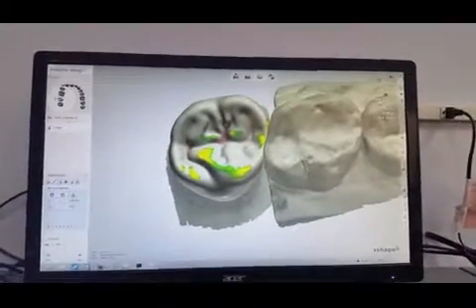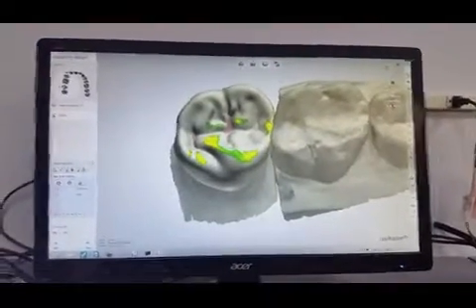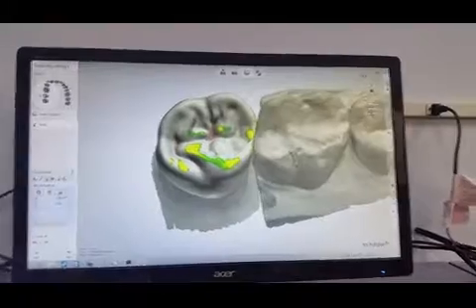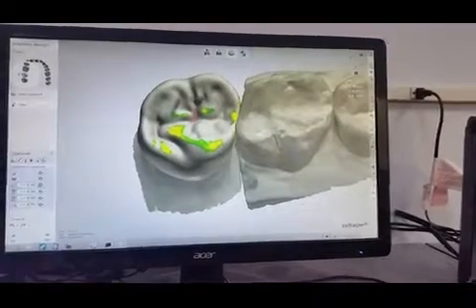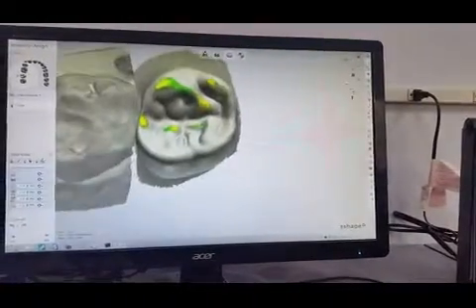Now with this option here, it's telling me that these red spots are below the minimum thickness that the material will allow us, which is 0.4 millimeter. Anything less than that, we're taking a risk of it breaking in the milling process. So we come here and we tell it to beef those areas, and it's done. And this case is pretty much done.